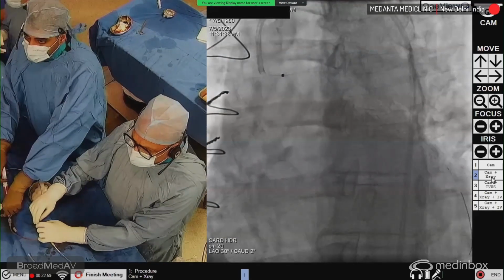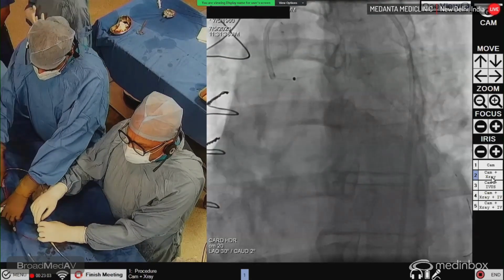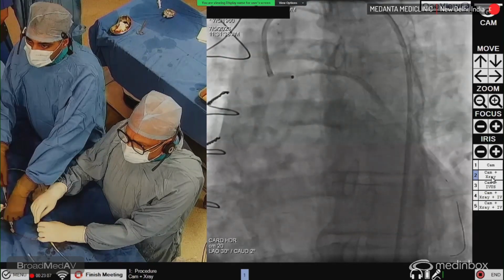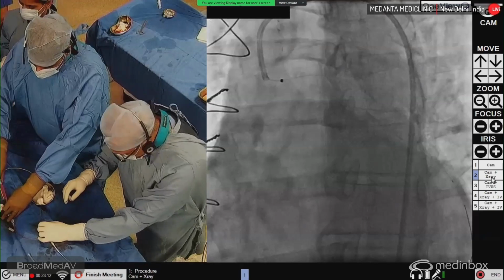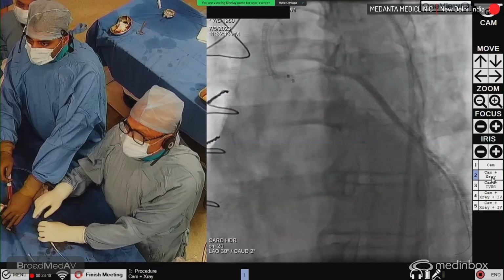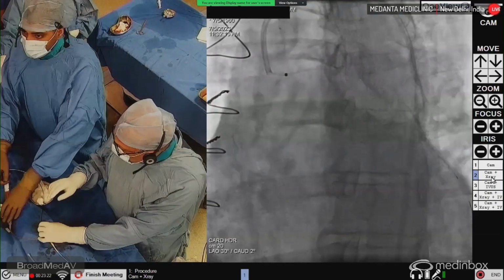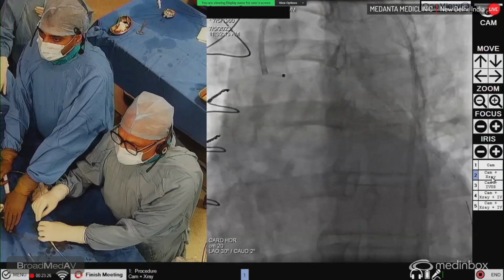First, we will check, because we have to be very careful. We are right there, and we are fine. We will keep flushing. The fluence is at 45. The rate is 25. He is flushing it with saline. Once I say okay, flush on, then we'll start. Flush on.